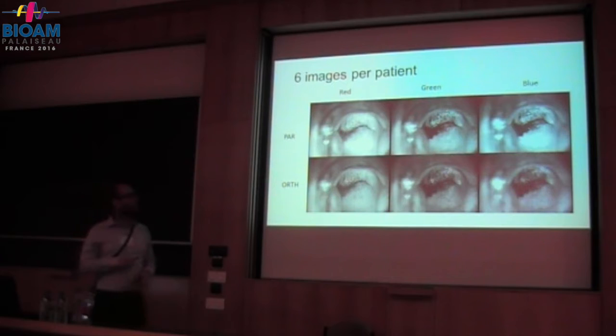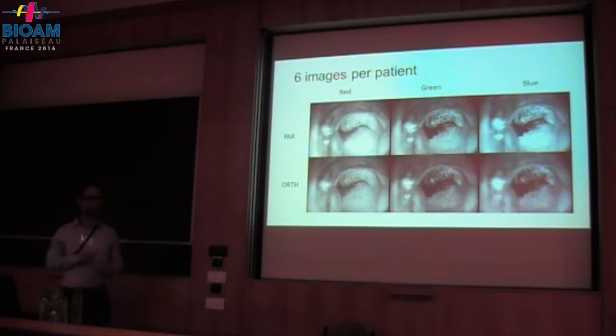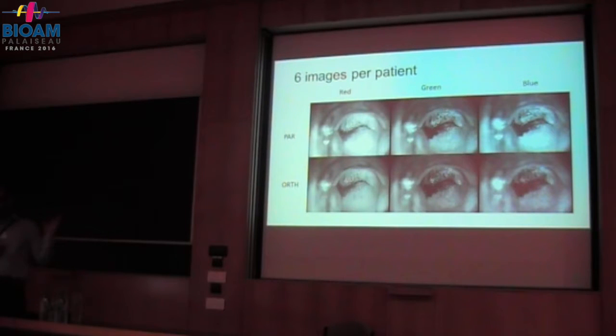Here are our data from a cervical image. We found out very quickly, which was actually confirmed by Tatiana in one of the talks that I've heard her give, that in the red and blue images we did not have the ideal information. We found that the blue was relatively noisy, and the red did not show that much clear information when we took the difference. The best contrast we got was in the green channel.